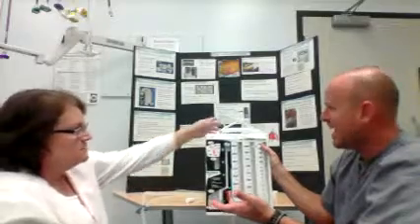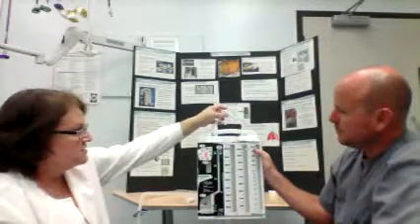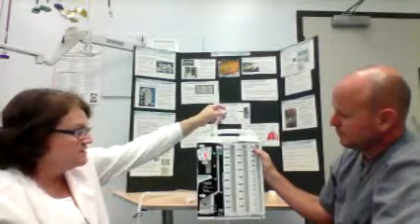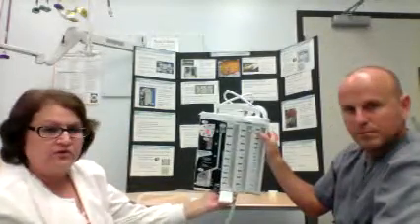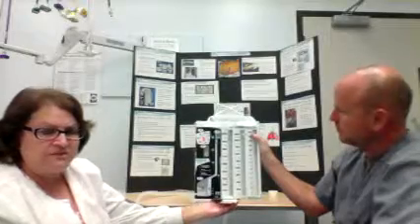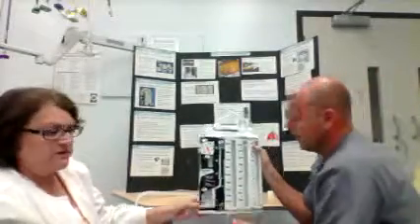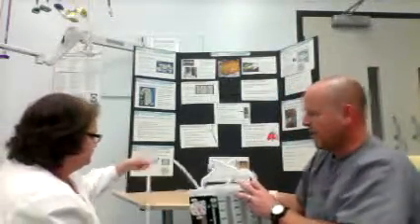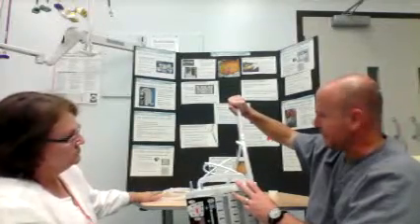Is there anything to add on that, Deb? And I think a lot of times most of your facilities recommend that you hang the drainage system on the bed, because if it's sitting on the floor, even though it does have a floor mount that will help it sit straight on the floor, if you're moving around the patient's bed a lot, it could get tipped over. So usually follow what your facility's guidelines recommend that you do. The only other part I haven't talked about is the actual tubing that goes to the collection device.